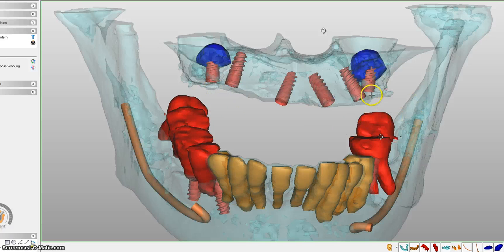It has locks on the side that you can open with a little pin. Once the locks are opened, you can remove the denture, clean it outside your mouth. You can clean the titanium bar with a toothbrush, and after you have cleaned everything, you can put it back inside your mouth and lock the pins, and it will not fall out anymore. It's completely fixed inside your mouth. It doesn't move, it doesn't fall out. You can smile, you can chew chewing gum, whatever you would like to.